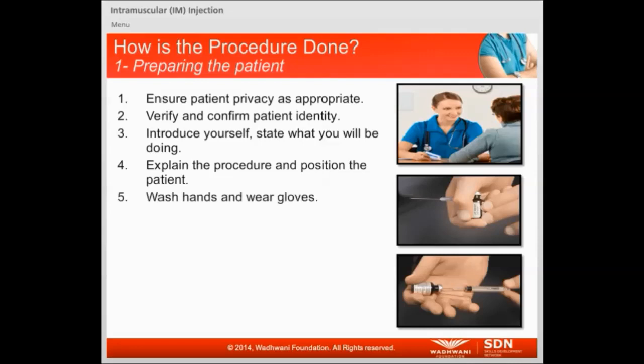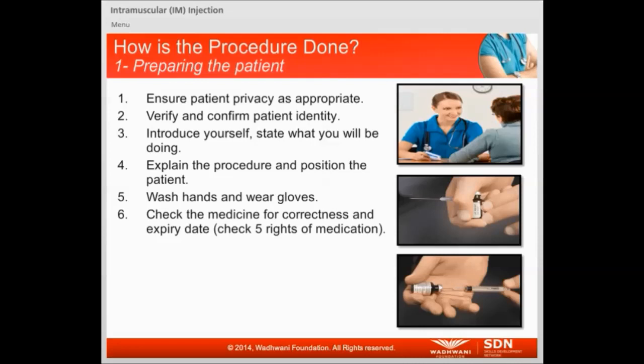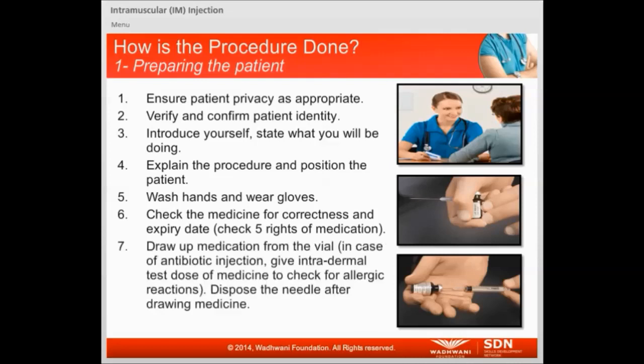5. Wash your hands and wear gloves. 6. Check the medicine for correctness and expiry date. Check the rights of medication. 7. Draw up medication from the vial. In the case of an antibiotic injection, give an intradermal test dose of medicine to check for allergic reactions. Dispose of the needle after drawing the medicine.